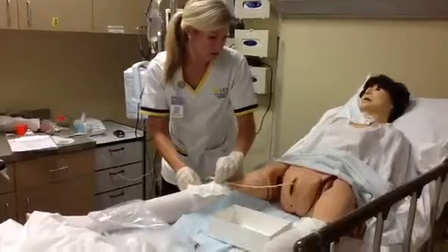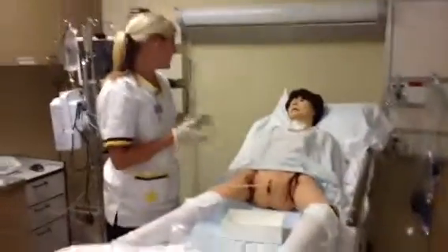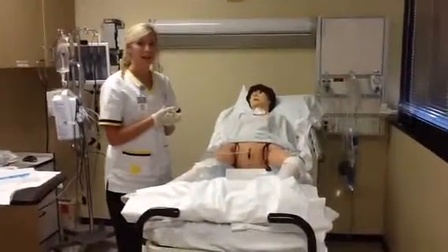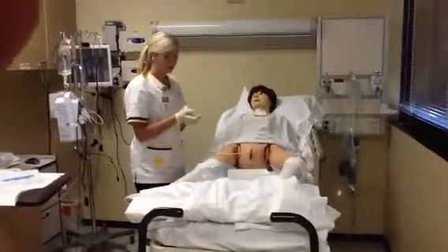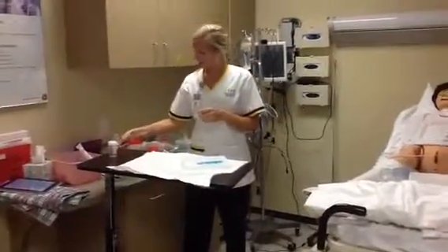I'm now going to make sure that Mrs. Knight tolerated the procedure okay, and I'm going to inform her that I will be back to perform catheter care every shift. And I'm going to document accordingly her input and output and the color of the urine and everything like that. So I can now go ahead and take my gloves off and perform hand hygiene.